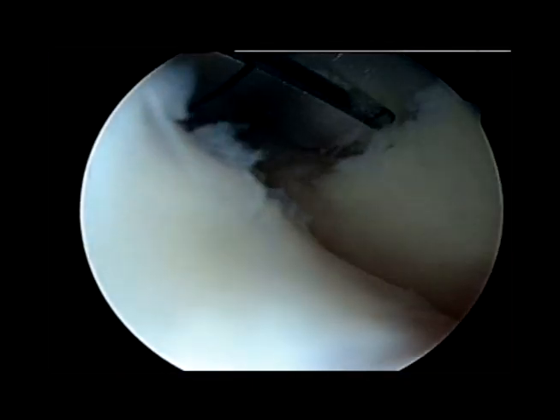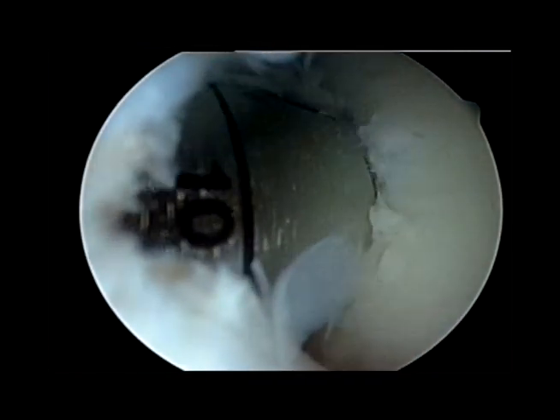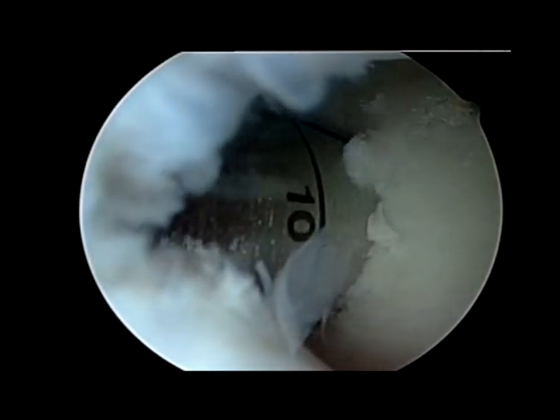Then we're going to create a hole in the defect site so that we can fill it with the cartilage. We're using these lines to get everything lined up as best as possible so that it is flush with the cartilage surrounding the defect.